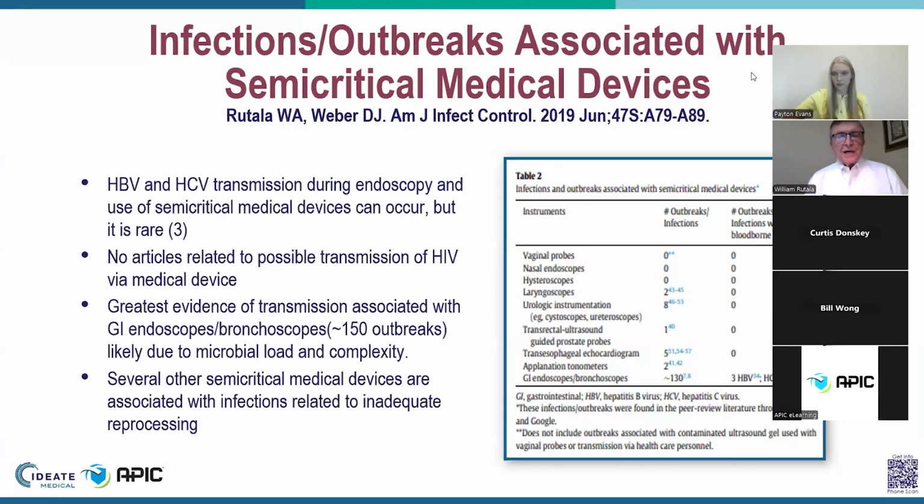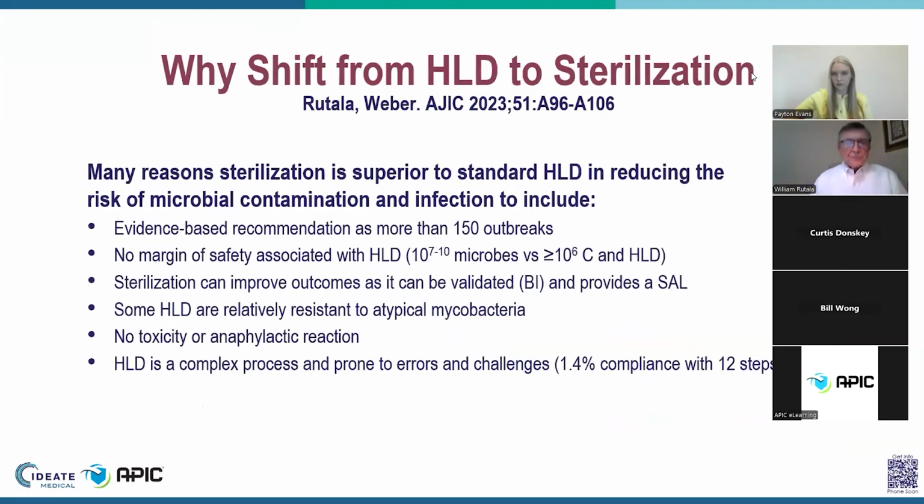In the next slide, we're going to continue this thought with the fact that there's no margin of safety associated with high-level disinfection. Now, why do we say there's no margin of safety? Well, the reason we say that is there are more organisms on a flexible endoscope in many cases than our high-level disinfection procedure can eliminate. That is, that our cleaning and high-level disinfection procedure can eliminate.